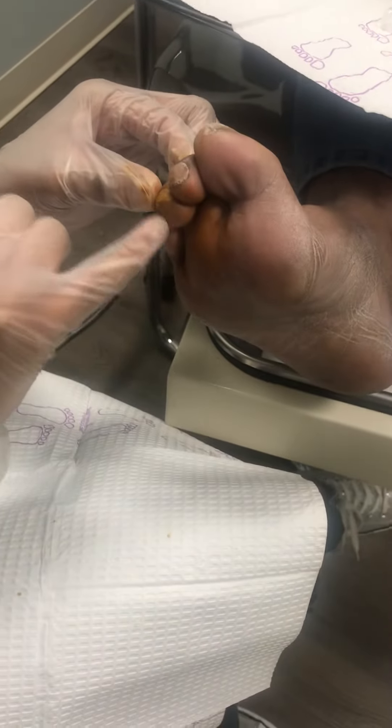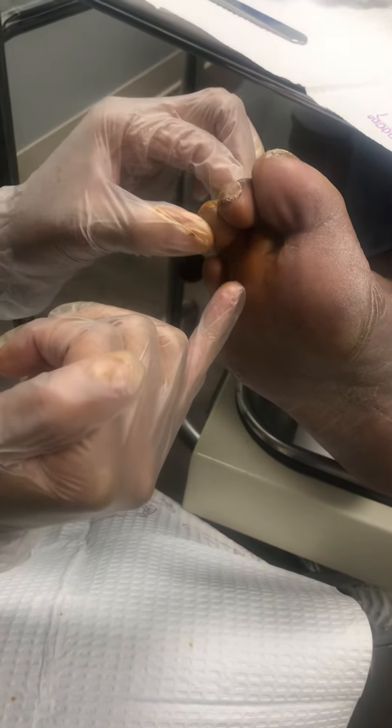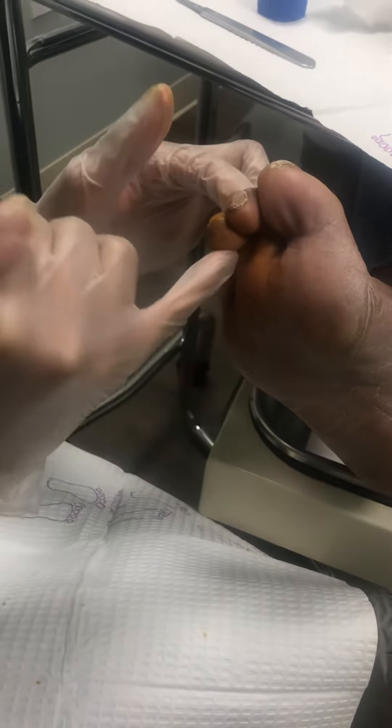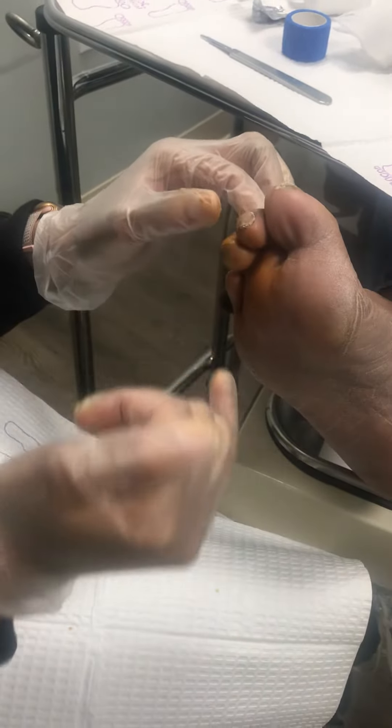As you can see there's a callus. When I shave that callus down it opens up into an ulceration. So what I'm going to do is cut the flexor tendon to get a little bit more straightening of this toe. It won't totally straighten it because she has arthritis in the joint, but at least take this toe off the ground so she stops walking on this toe essentially.